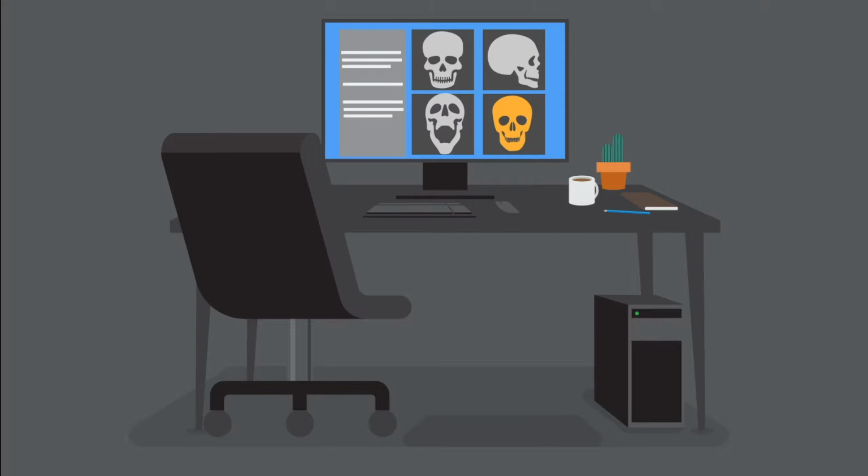So turn the lights down. Make the room as dark as possible. Suddenly, you will start to see better. Keep your workspace clean. No extra lights, no clutter. I'll remove that flower pot. Anyway, the flower was not very happy in the dark reading room. Okay, I'll keep that coffee only if it is in my home office. Don't bring coffee or any liquid to our clinic reading rooms. Liquid and electronics are not real friends.